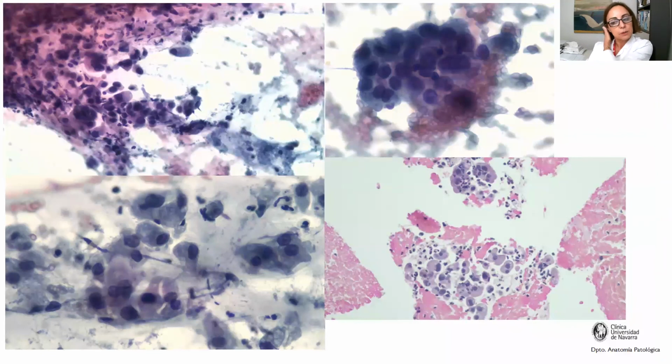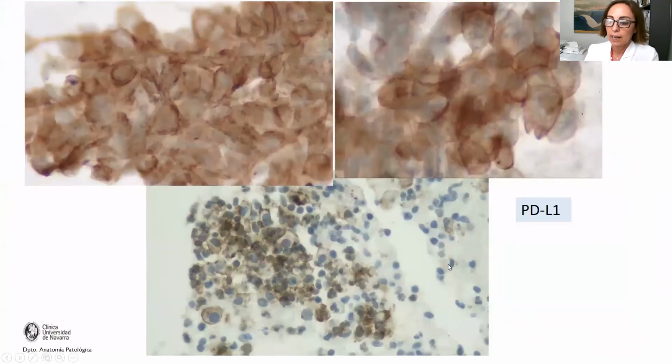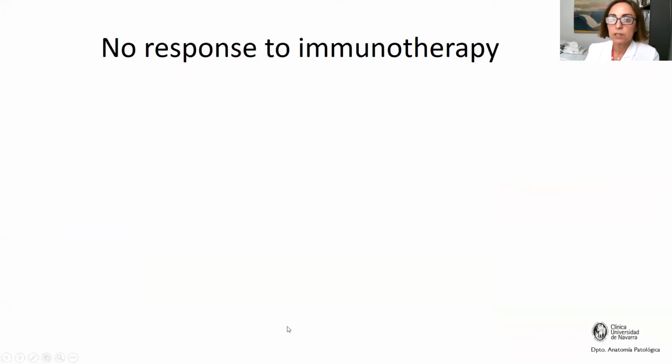Here are the smear and the cell block. I'm sorry because it is not beautiful cytology, but this is what we had in this case, and this is the real case. So these are the tumor cells on the cell block. TTF1 was positive. And I want to show you the PD-L1. We performed PD-L1 on the smears and on the cell block, and the positivity was really high.